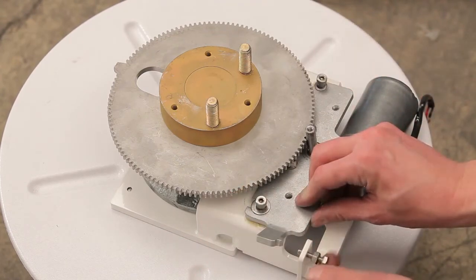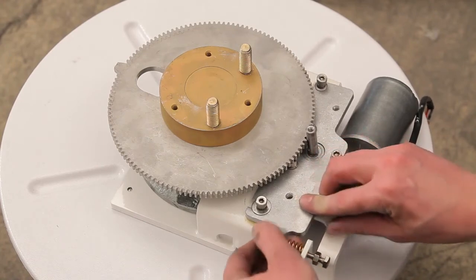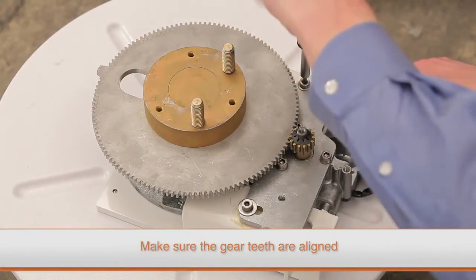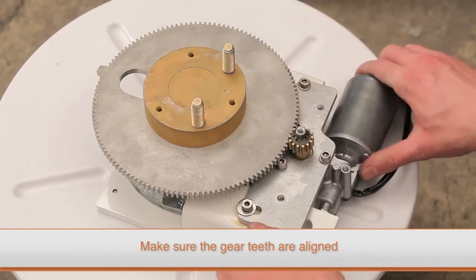Next, insert the tension spring onto the tab in the mounting plate and slide the spring over the tension adjustment bolt, which is installed in the base frame. Position the mounting plate so that the teeth of the small gear align with the teeth of the large gear so that the gears engage without binding.